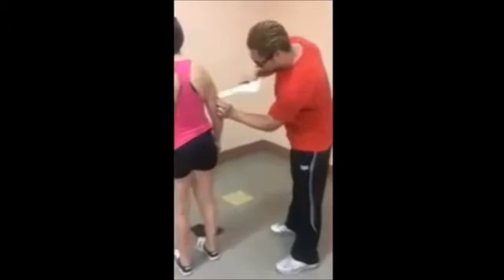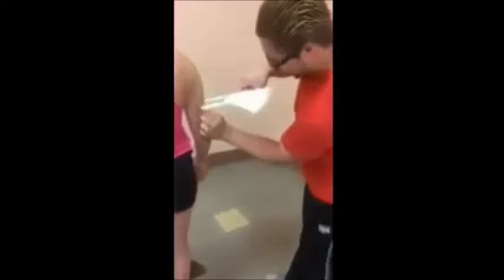We will be taking the measurements with the caliper in our right hand. We will take the measurement either a centimeter above or below the markings. Measure halfway between the crest and the base of the fold. Take the reading within the first one to two seconds.